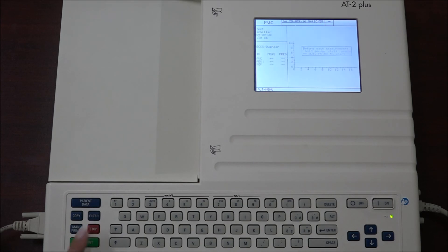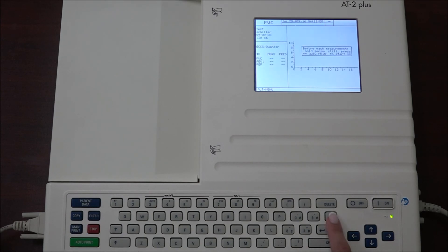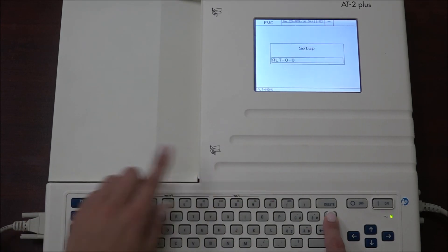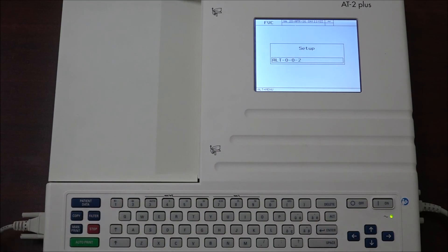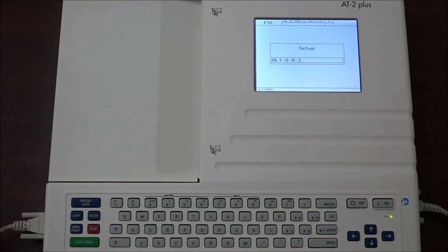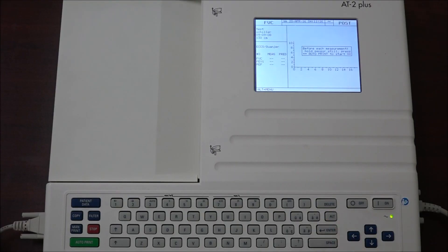To define the miscellaneous print settings, the following codes are used. Begin with ALT 0 0 2. The measurement setup defines how the FVC graph is displayed and printed. The report type defines the measurement on which the interpretation is to be based.